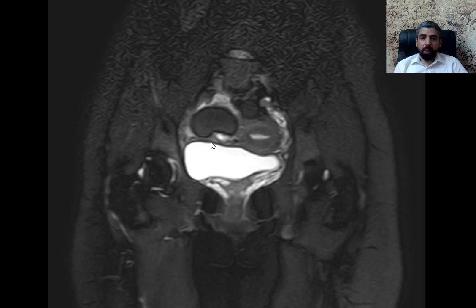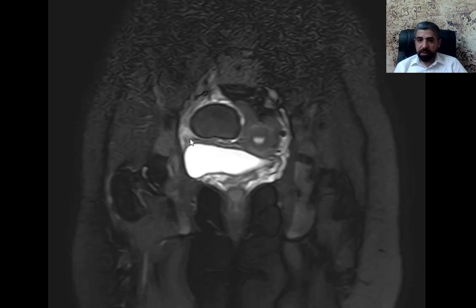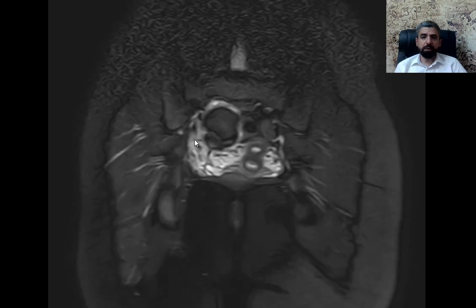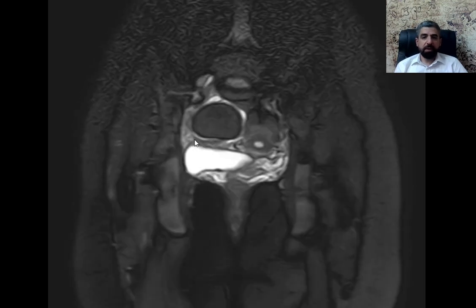So what is this lesion? What could it be? What is hyperintense on T1, hyperintense on T2, and loses signal on fat-saturated images? We will answer these questions tomorrow in our discussion. Thank you very much for listening.